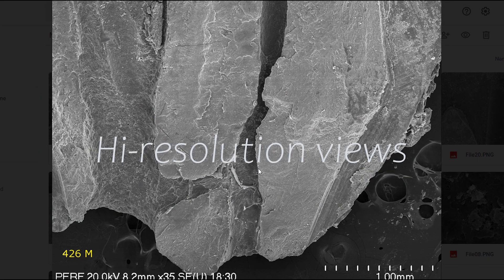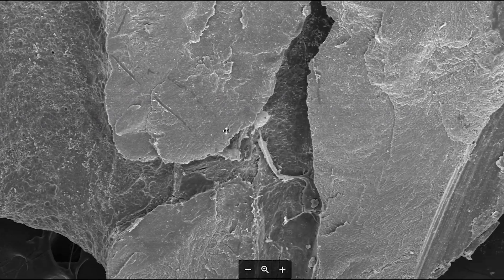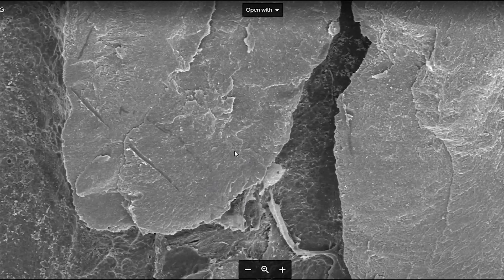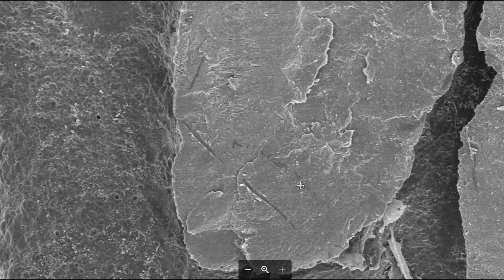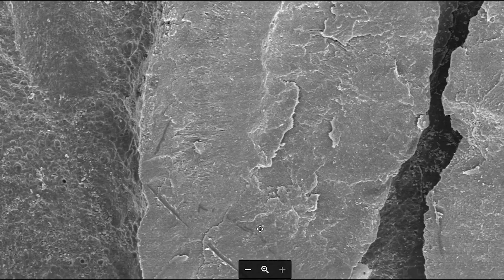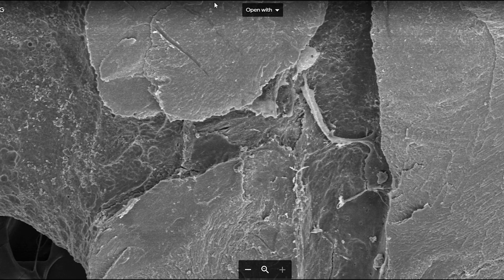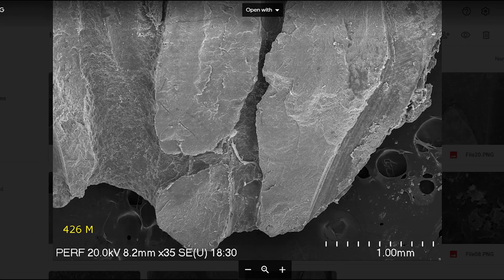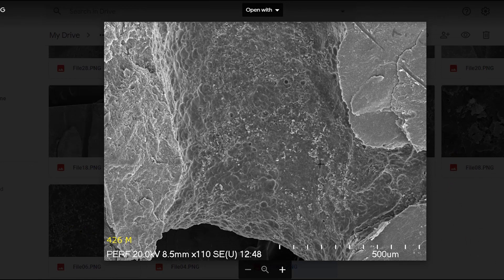These are the high resolution views. As you can see, the mesial buccal and mesial lingual canal look very well cleaned out. We'll take a closer look because when you're looking for biofilms, you really have to do it at very high magnification or you may miss them. It's very easy to miss endodontic biofilms in teeth, so you have to be very careful in the way you examine these.